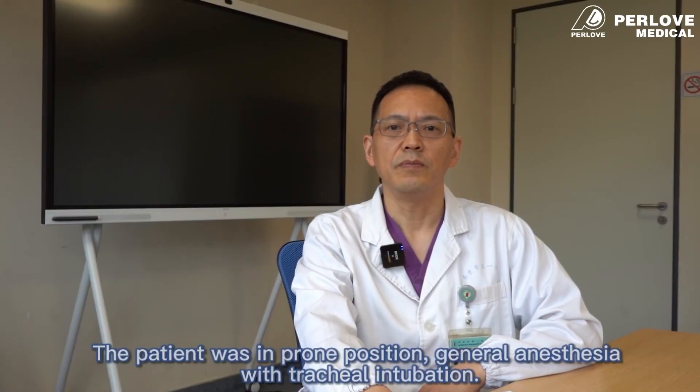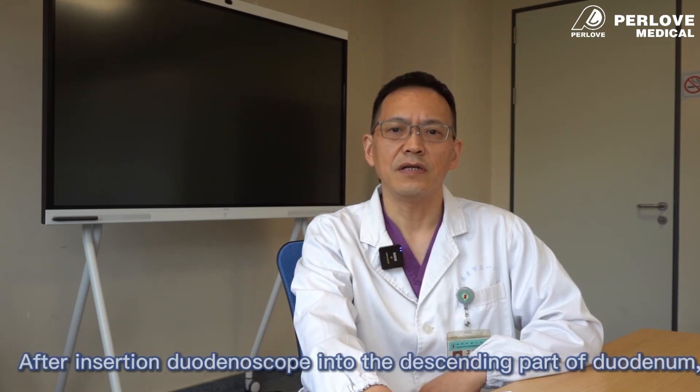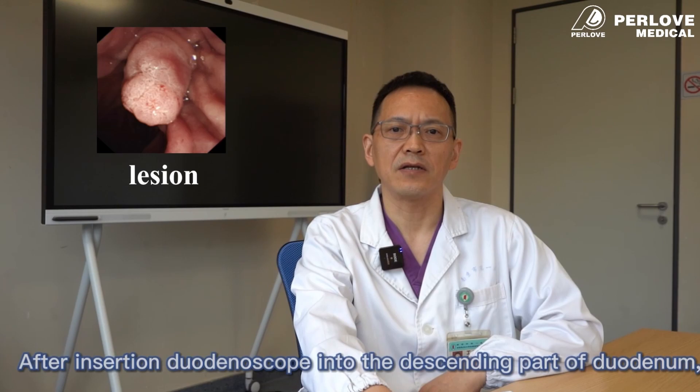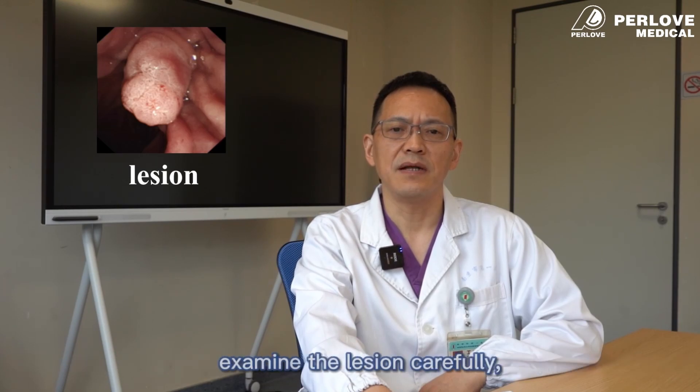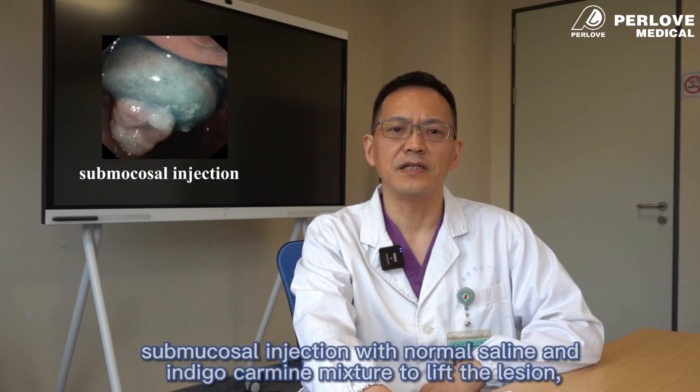The patient was in prone position under general anesthesia with tracheal intubation. After inserting the duodenoscope into the descending part of the duodenum, the lesion was examined carefully. Indigo carmine spray was used to define the extent of the lesion, followed by submucosal injection with normal saline and indigo carmine mixture to lift the lesion.